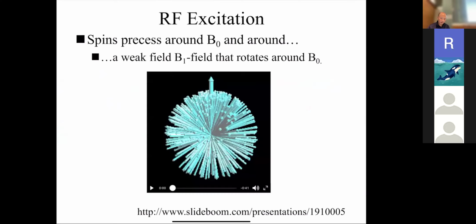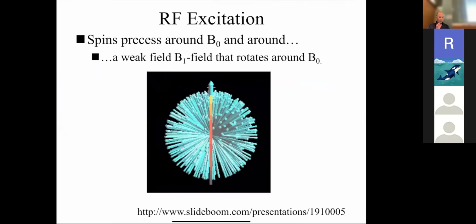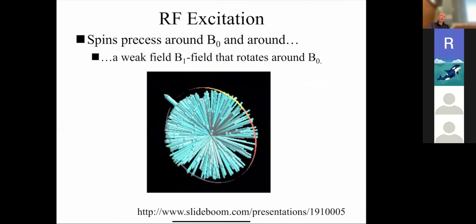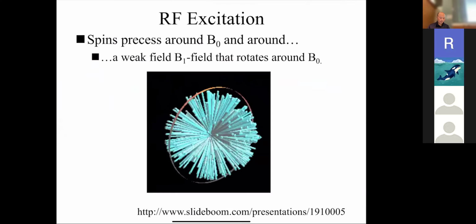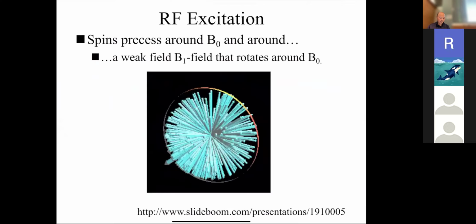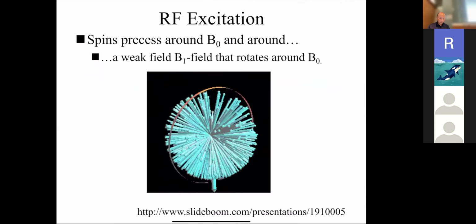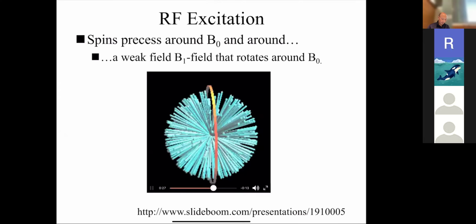So this is what it looks like. Imagine this is our Cush ball with a net magnetization going this way. If we apply an excitation pulse, everything is precessing, and as we apply that, it tends to move the whole magnetization away from equilibrium. The longer we apply that pulse, the more it moves away from equilibrium. And then it'll start coming back.